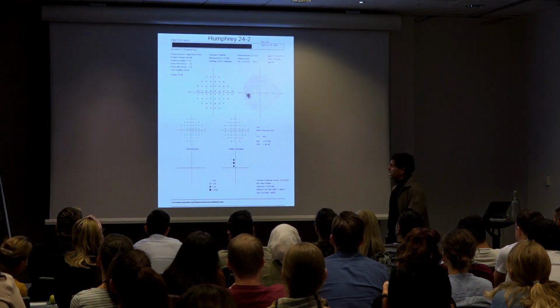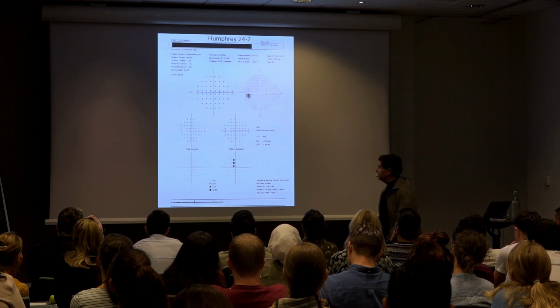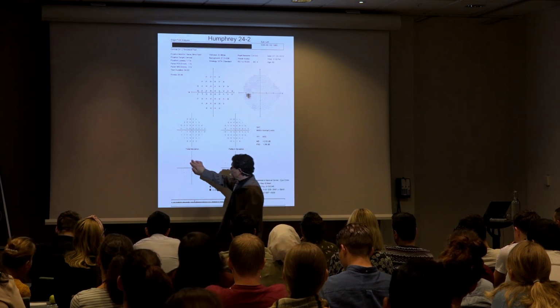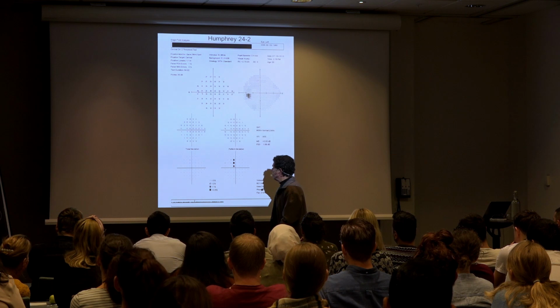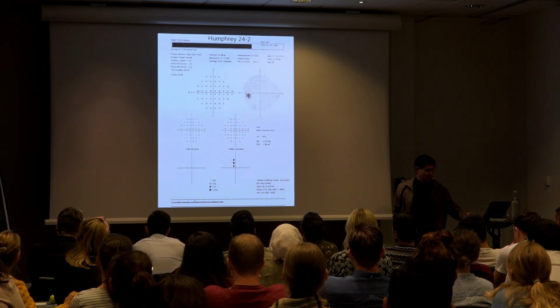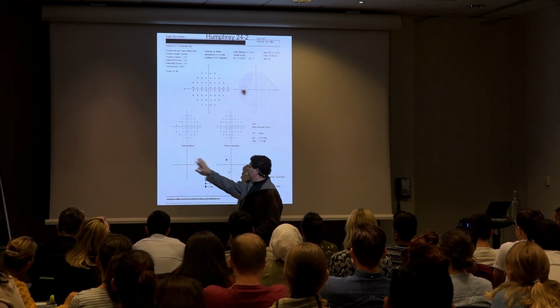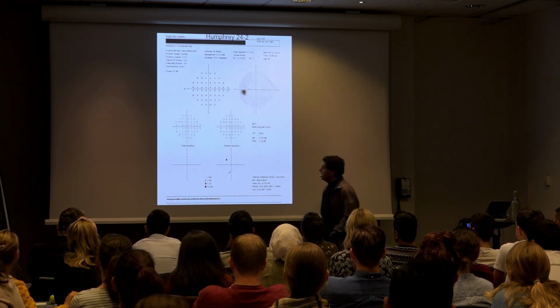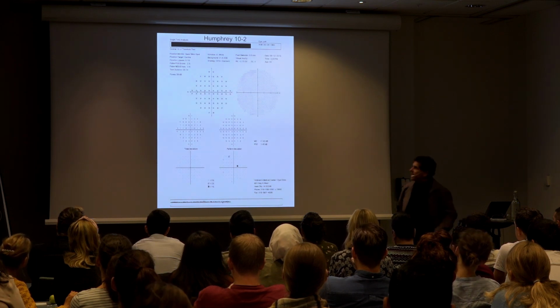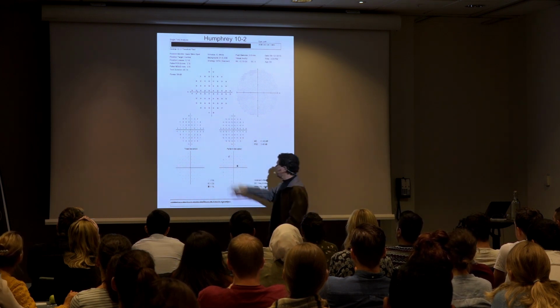And remember, we only have the visual field of the left eye. So here was the visual field. You can see that there's not a whole lot. Maybe there's a few points here in the pattern, and we're wondering if there's an arcuate defect, early glaucoma. This was repeated, and now there's really nothing there, maybe a couple of points here, so not a lot that looks worrisome. He even had a 10-2, which again didn't show much of a problem, just a few scattered points.